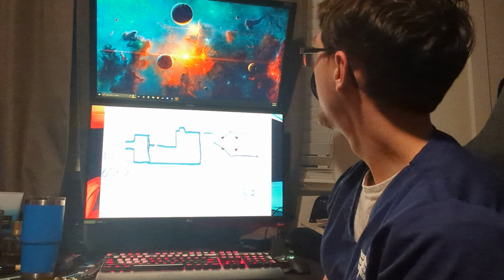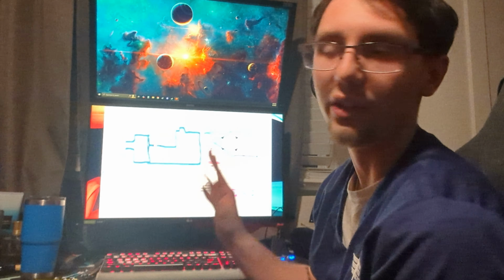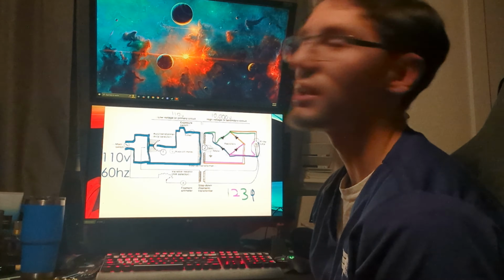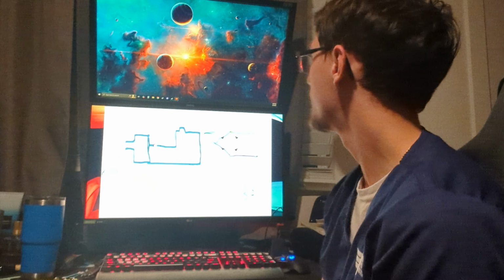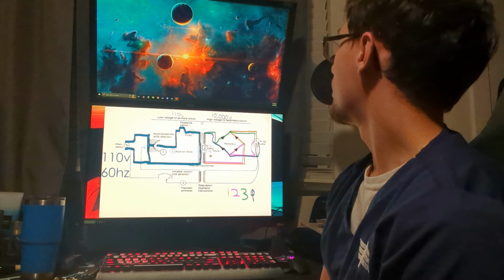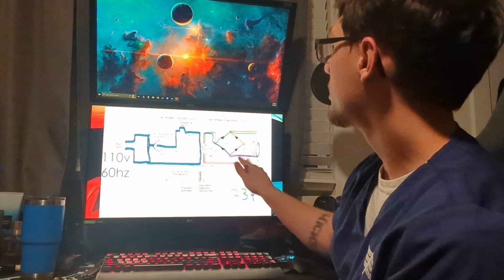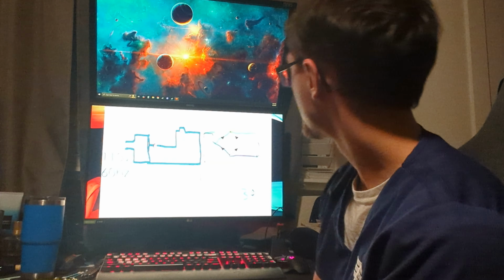Crazy, huh? So that 10,000 volts isn't going to be released in one burst though, which is important to note. It's going to be stored in capacitors and slowly trickle through in what's called a falling load type generator. Okay? So now that we established that this is going to be our high voltage side, and we're over here now, let's talk about some of the important parts of this side.